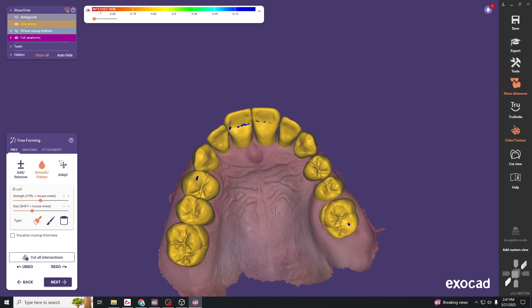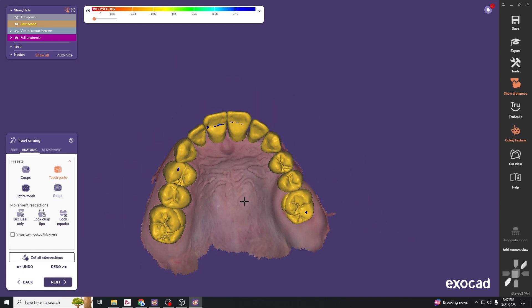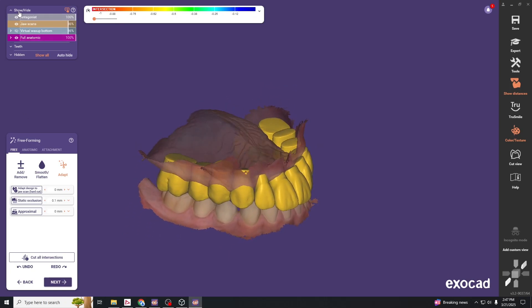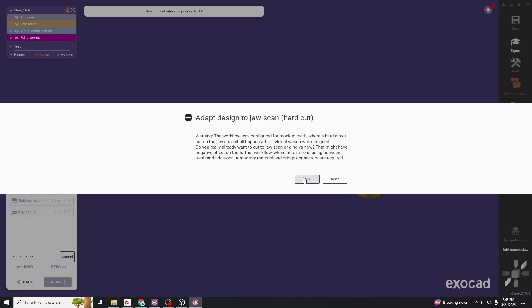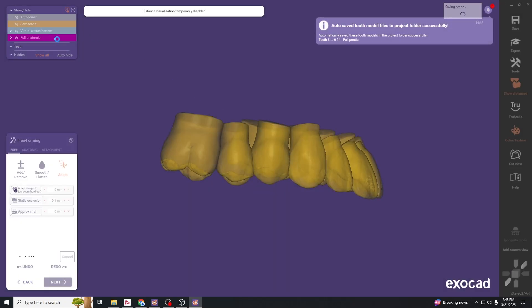Make sure the teeth are contacting — some can be moved out and widened slightly. Finish the adaptation: proximal adaptation squares away the interproximal contacts, and then the last part cuts to our jaw scan. You can see the underlying tooth structure, and when we hit adapt to jaw scan it cuts that out, so the occlusal surface dictates the intaglio surface of our snap-on smile.